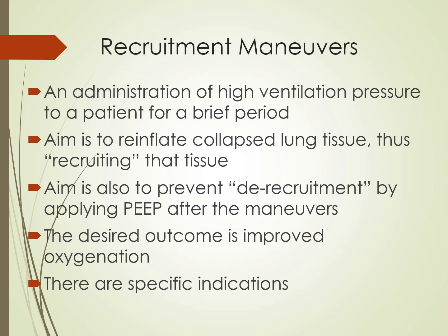The goal is to reinflate collapsed alveoli and then keep them open by the application of PEEP at the end. So if you are doing a recruitment maneuver correctly, and then you don't adjust the PEEP at the end of the maneuver, you just did this for nothing. The lung will de-recruit and you'll have collapsed alveoli. So the goal is to use a high pressure for a short period of time, an inspiratory hold, and then apply PEEP at the end.